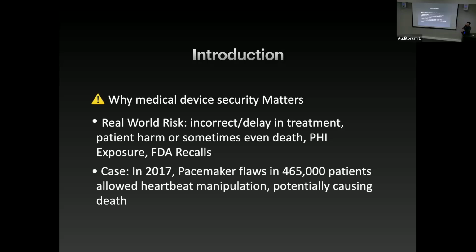But that wasn't even the main problem. The real challenge started after that. Since it is implantable, some patients would have to go through invasive surgery to get the implants removed and update the firmware. That's what makes it much more difficult, because some people wouldn't have survived that surgery. So even though the fix was issued, it's not easy to fix these kinds of attacks. That's why we need to think from a 360-degree view: what are the pros, what are the cons?